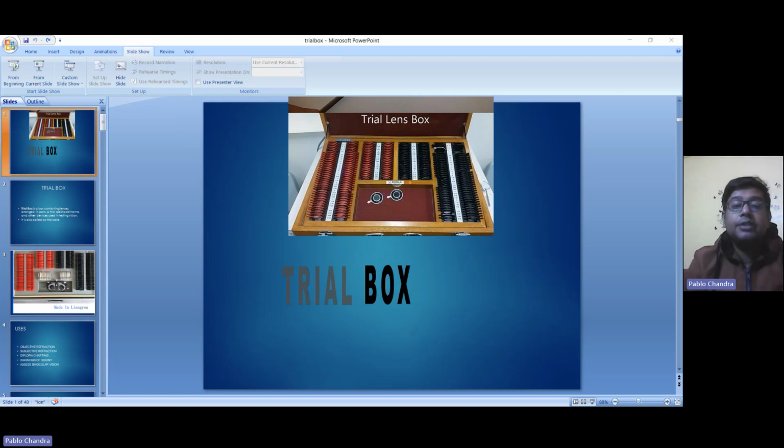The pinhole of 1.32 mm. So the hole size is very important. You cannot use any hole. A hole size of 1.32 mm is more effective. Usually the available pinhole is 1 mm in an ordinary trial box. In an ordinary trial box, we get a 1 mm pinhole.